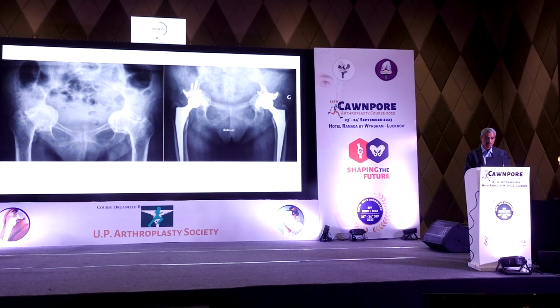This, of course, I showed you earlier, a rheumatoid sort of situation. So again, the biomechanics have been restored, but the difficulties intraoperatively are always there. One needs to be careful. Osteoporosis, protrusio, and the tight soft tissues around, all those need to be addressed in a very meticulous and careful manner.